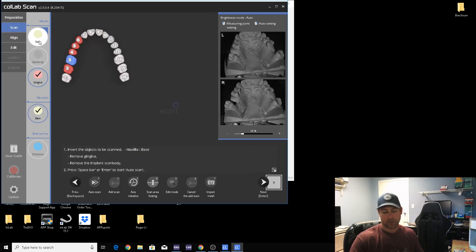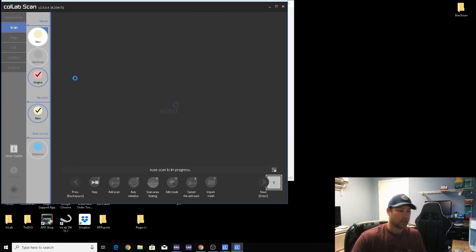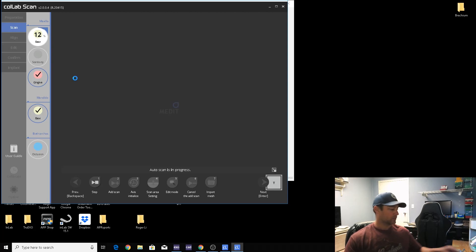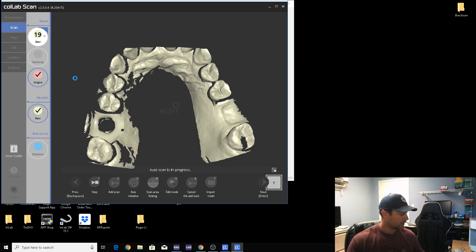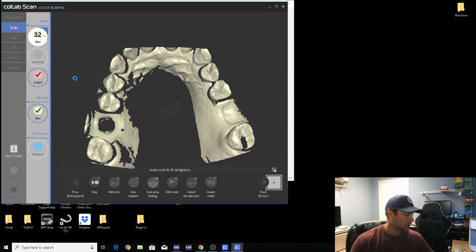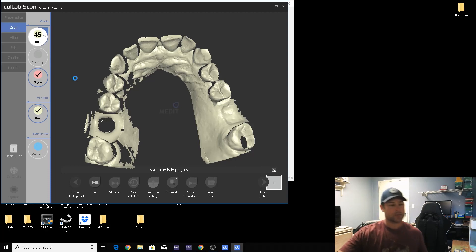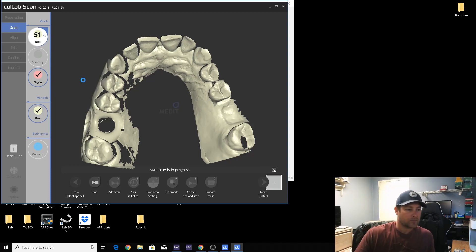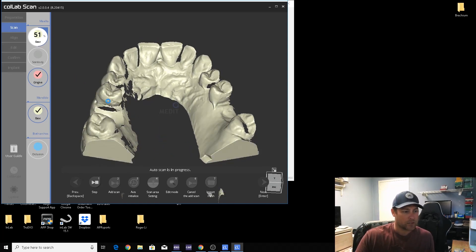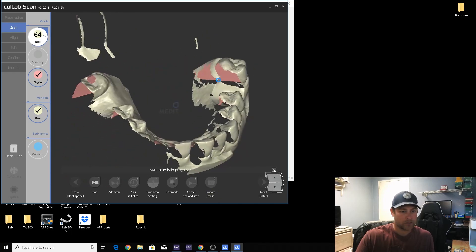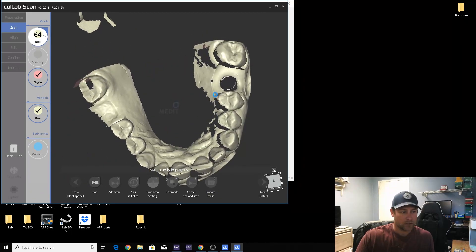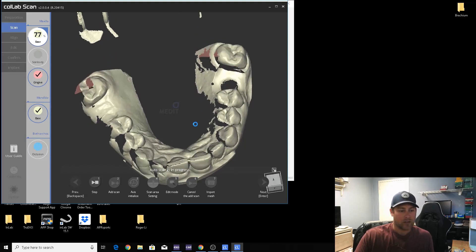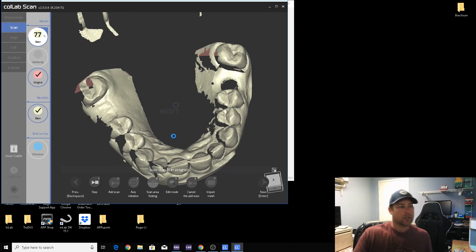All right, now we'll do without the scan body. Go back up here to the base, and then next we will scan the prep. Just screw it into place using the right driver and you'll be good to go. I'll show you how to orientate the scan body with the implant library and design a proper emergence profile and all that stuff.